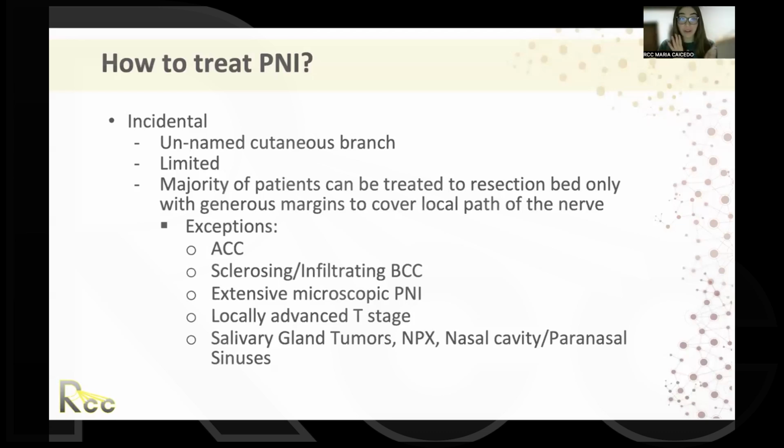Dr. Parag, I have a question for you. Sure. So this is not in the chat, it's from me. But are we talking here, or does it depend on the nerve caliber or the length and depth of the perineural invasion, or here is the overall perineural invasion? Because sometimes we use that nerve caliber extent to define what we're going to do. So I wanted to ask you this.